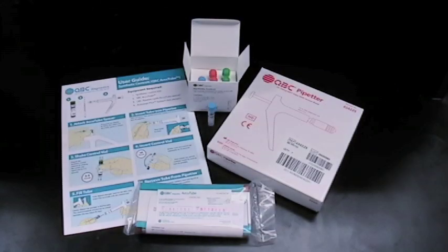You will need the following items. From your beta test kit, you will need a vial of QBC Synthetic Control, an Accutube with Float Enclosure, and a QBC Pipetter with Accutube Spacer.